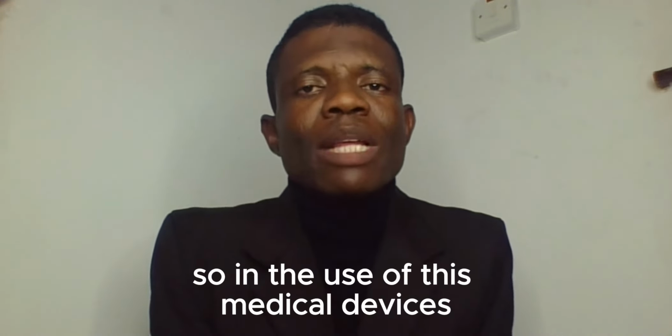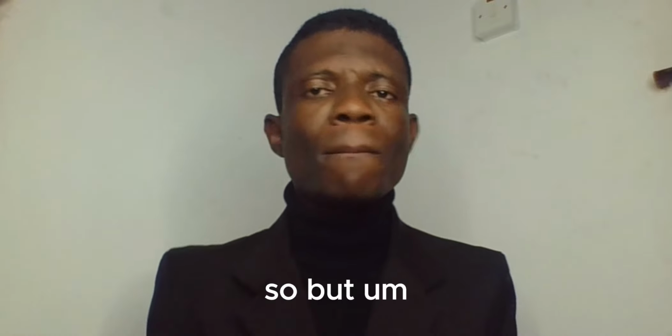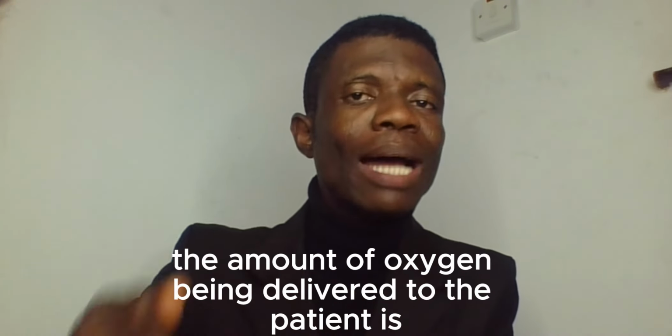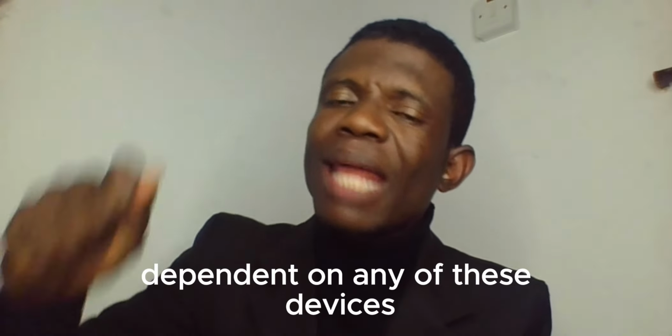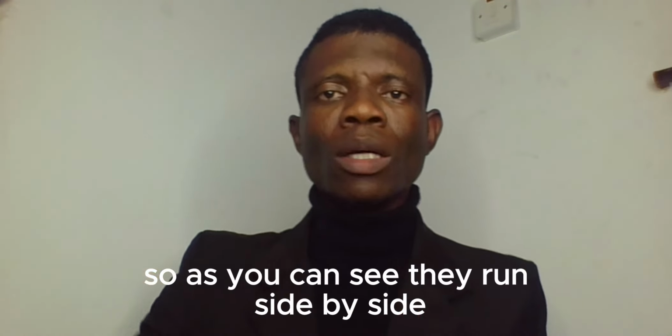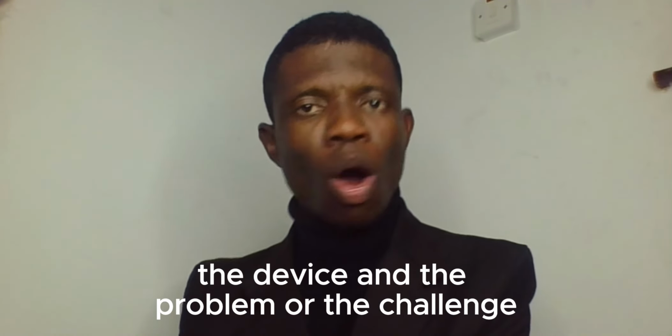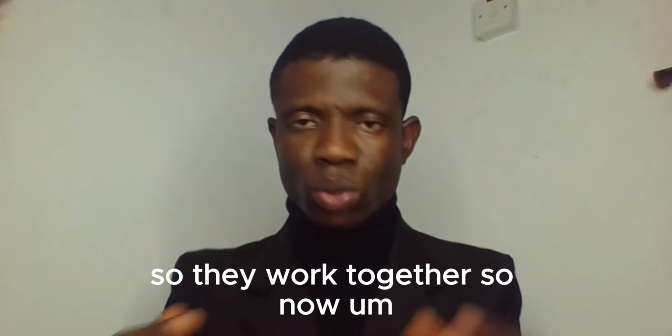So in the use of these medical devices, the problem comes first. But the amount of oxygen delivered to the patient is dependent on the device being used. So as you can see, they run side by side, the device and the problem or the challenge. They work together.